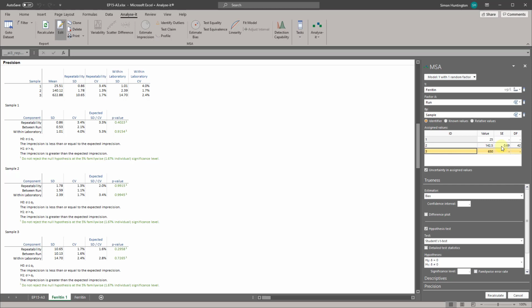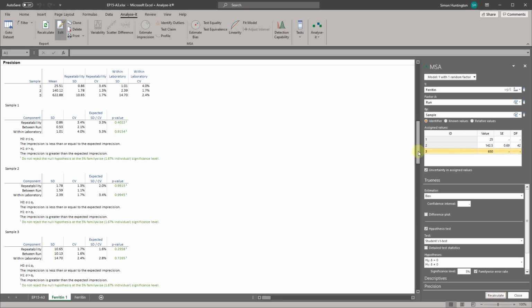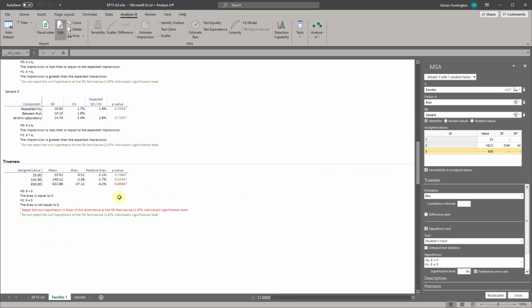In the significance level edit box, type 5% and select the family-wise error rate checkbox. CLSI EP15-A3 uses a family-wise significance level. So the overall significance level is a maximum of 5% regardless of the number of levels tested. Click Recalculate and the analysis report updates. The table shows the observed and expected value along with the bias and the hypothesis test p-value for each level.